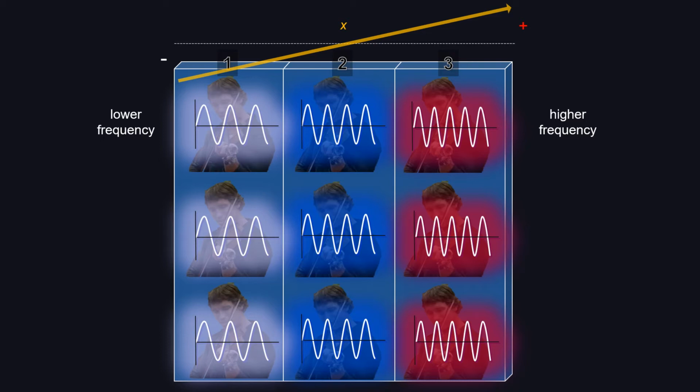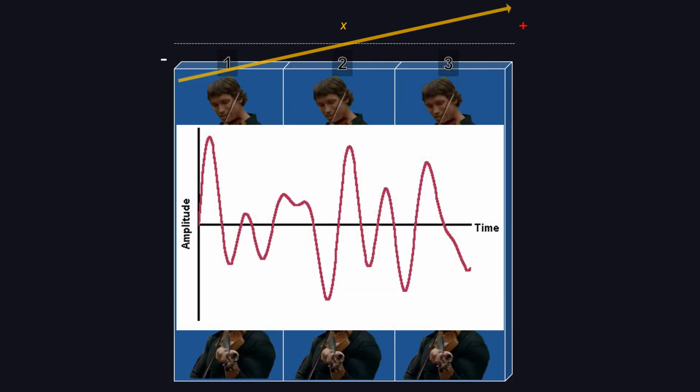The thing is though, you hear the music coming toward you, they don't come at you individually as a small component of music. The music will come together toward you as one large chunk that comprises the summation of the different frequencies, forming this relatively complex looking wave. So you have high frequency signal, medium frequency signal, and low frequency signal. When they play together, they are additive and they form one complex signal coming toward you.